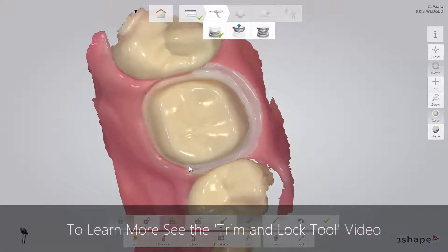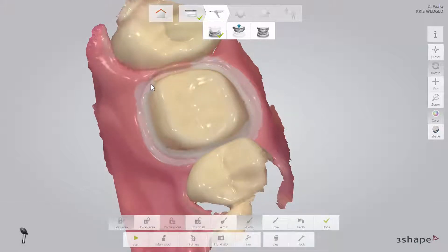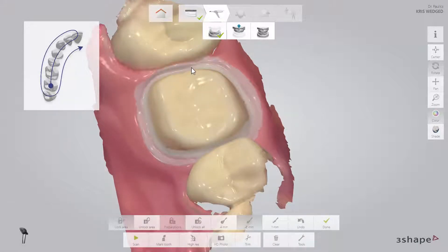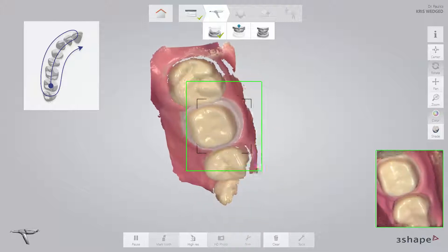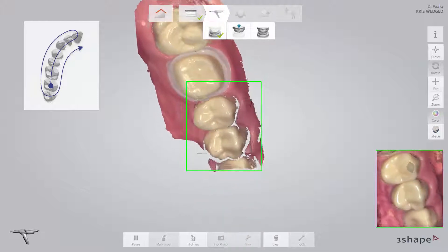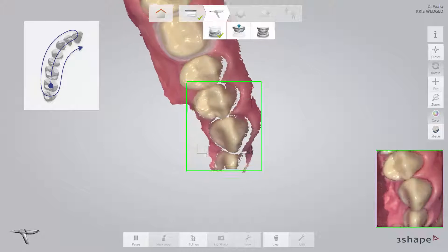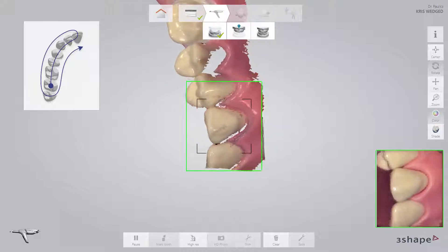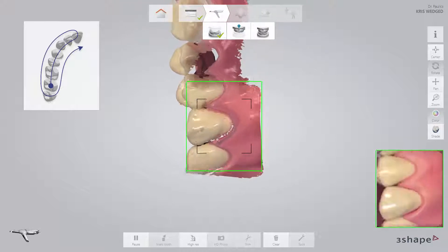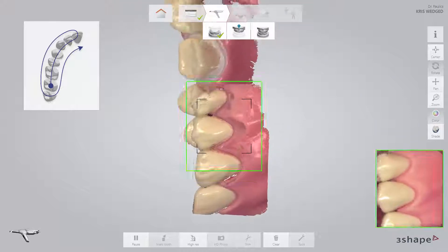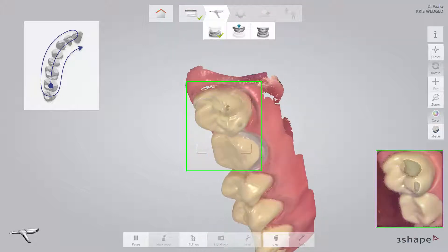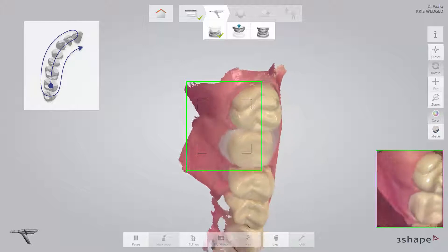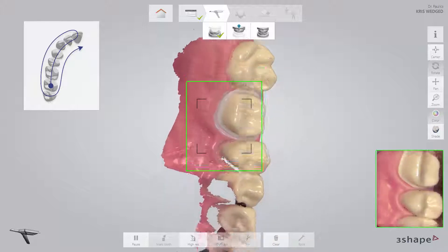This prevents the margin from being updated with later data when the gingiva might be collapsed. See the Trim and Lock Tool video for further detail. Then complete the scan using the official scan strategy: continue scanning the occlusal surface from the preparation to the canine, slowly roll to the buccal side and move the scanner in the distal direction, then slowly roll over the last molar and scan the lingual side.